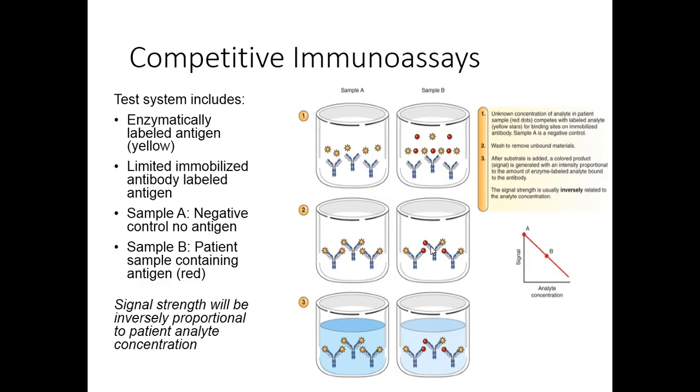And so we're going to be competing for the open spots between them. And the relative patient or control antigen concentrations are what will determine how much of each gets bound. So it's definitely a relative step. And remember, the signal change, the signal strength we just saw, it's inversely proportional. High signal change, low concentration, that's inverse. They're one high, one low, right? Low signal change means a high analyte concentration, inversely proportional. I hope that concept of inversely proportional makes sense. If it doesn't, please come see me or send me an email. It's really important that you understand that.